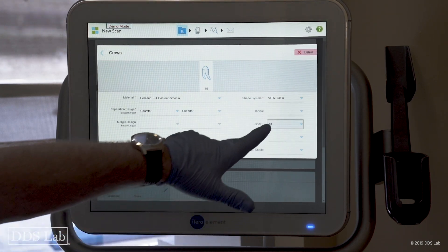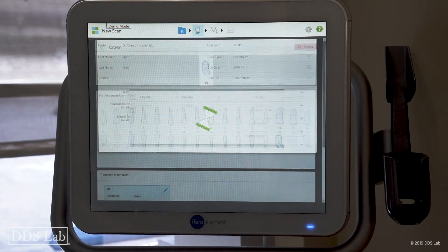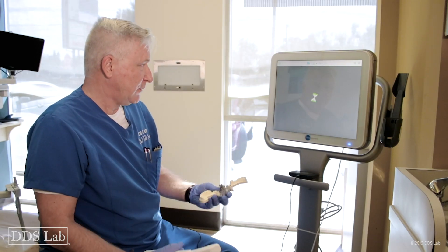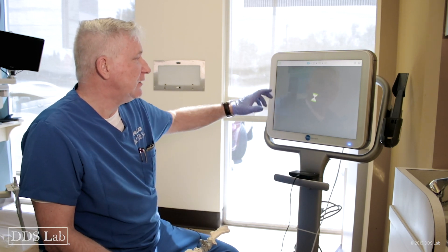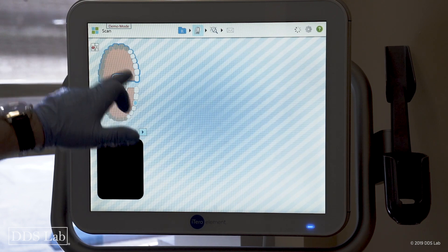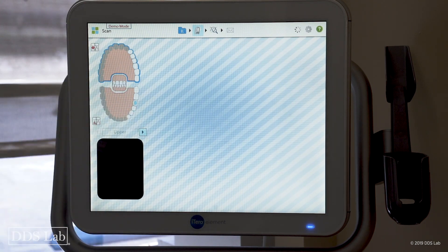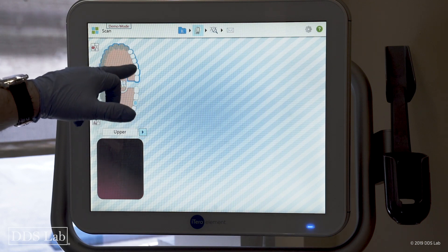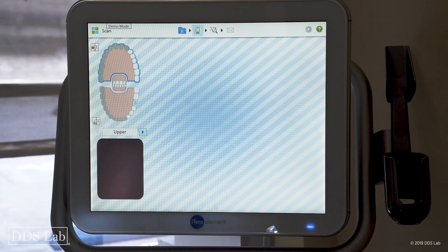I'm going to choose the material: full zirconia, chamfer. We've filled out the shade, and now I'm going to go ahead into the scan section. I'm going to start scanning the opposing arch first, which is already illustrated right here. Everything I see in white is what the computer wants me to scan.